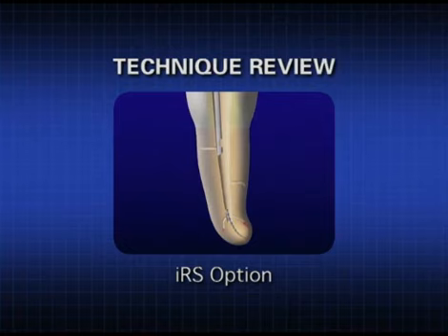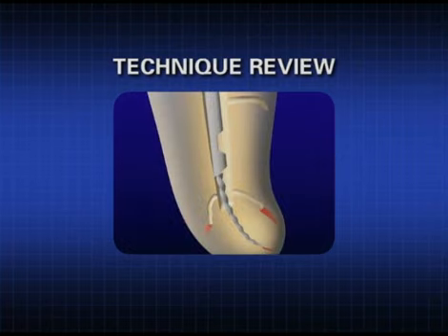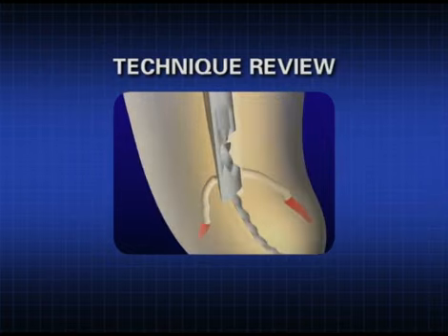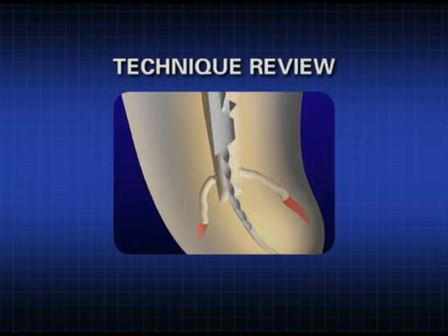The microtube is introduced so its beveled end is oriented towards the outer wall of a canal curvature. This facilitates scooping up the head of the broken file. Once the microtube is fully seated, the screw wedge is inserted and internally approaches the broken file when rotated counterclockwise. The screw wedge then engages and displaces the head of the file out the side of the window, allowing for a strong mechanical purchase and the removal of a broken instrument.